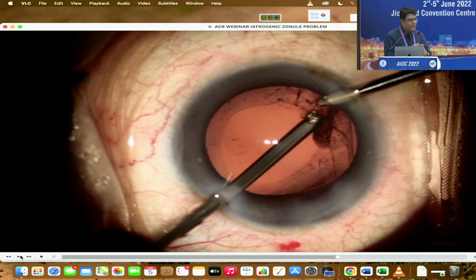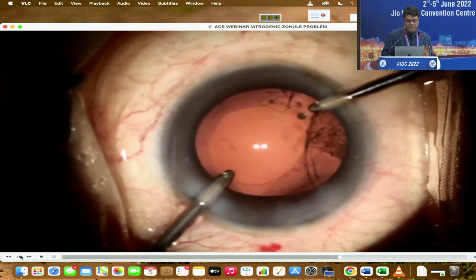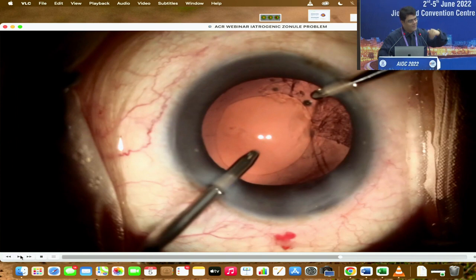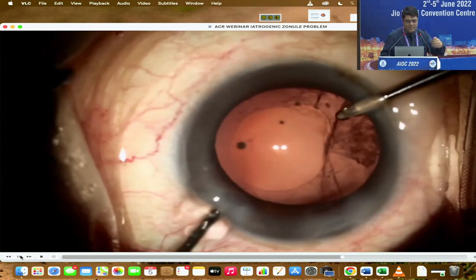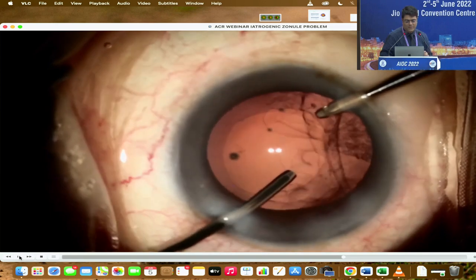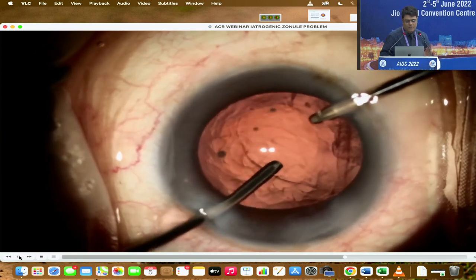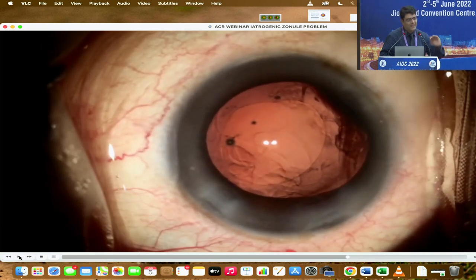So whenever we touch a hot oven, we just take off our hands. Whenever you have a situation like this, don't take off all the instruments. Keep calm. At this stage, I am trying to just push it there, because whatever has happened, it's a traumatic, iatrogenic dialysis. It's not a progressive thing. So now I'm going ahead, keeping my irrigation there, and whatever visco is there on the table, I'm using it first. I'm putting visco, and now turning off irrigation and coming out, so that area is now settled.